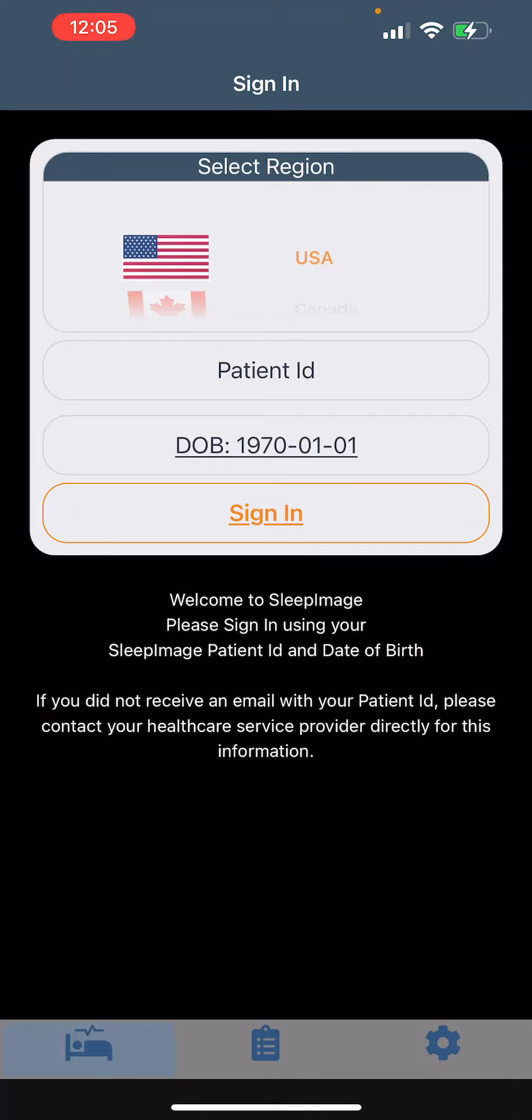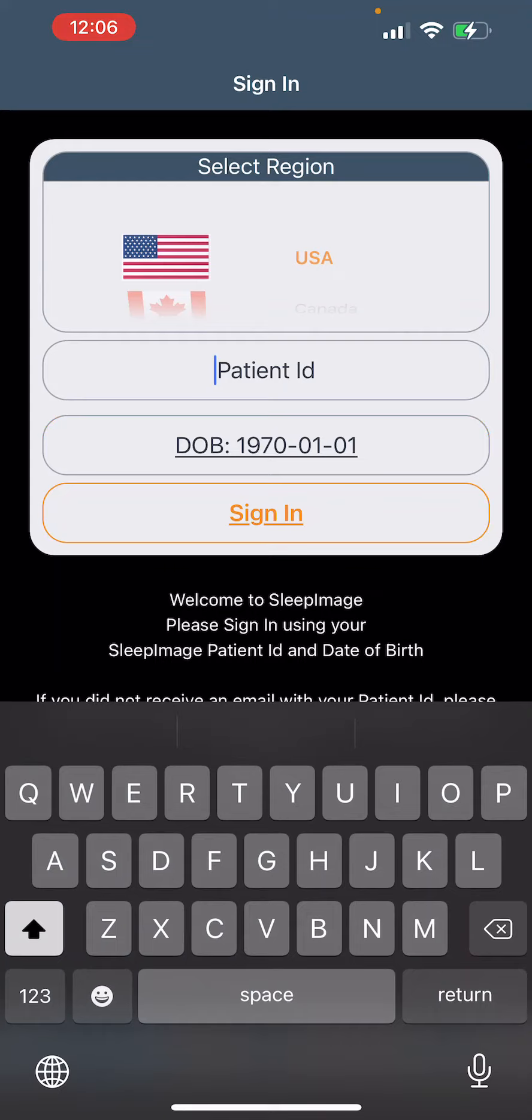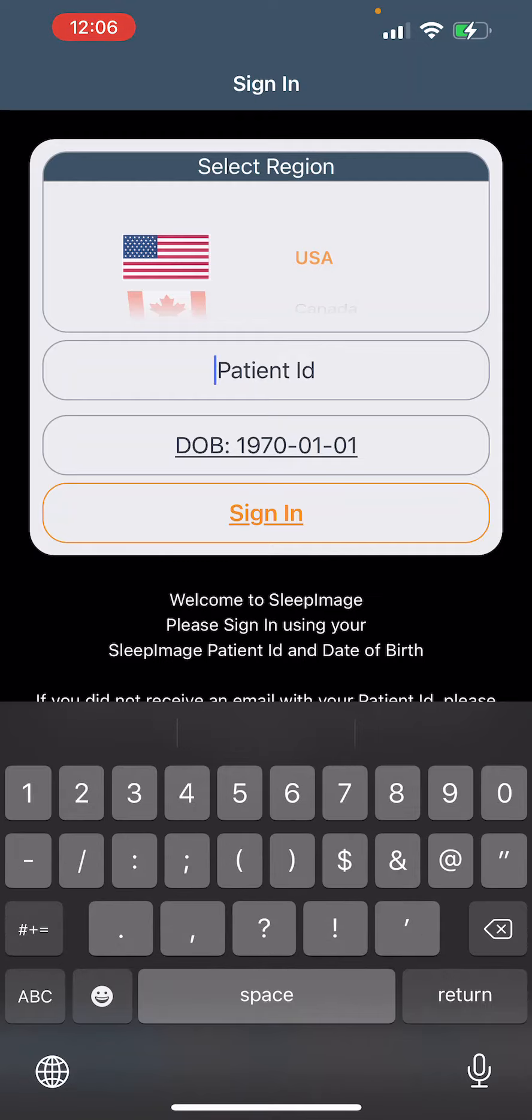The first thing is you're going to put in your patient ID, which you should be getting through email. I'm going to go ahead and put that there.